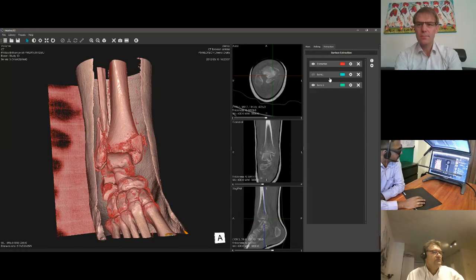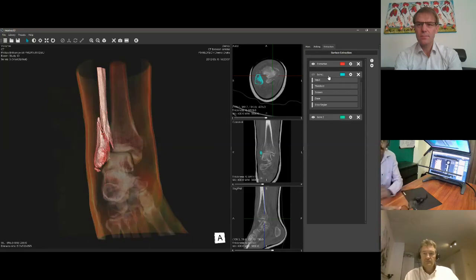And although it's still medical data, it's complex data, we want to make this data so easy that anyone with limited knowledge can understand what's wrong with it, but definitely anyone who's been explained to what's wrong with it should understand what it means. And that's why I wanted to show you this fracture.